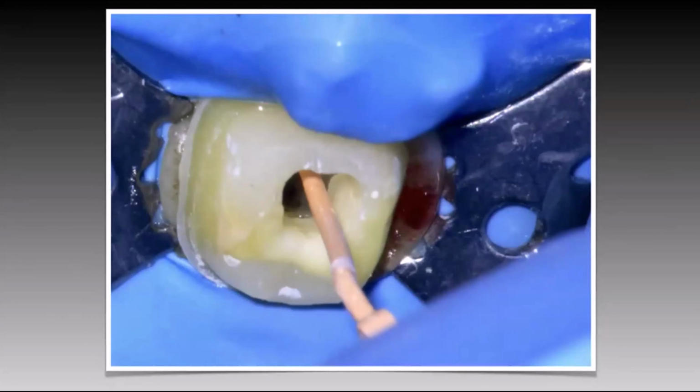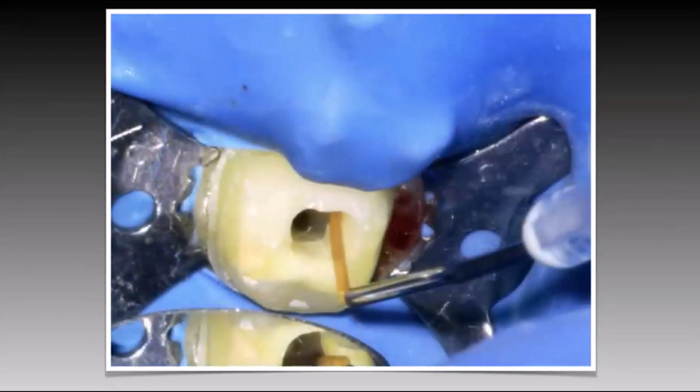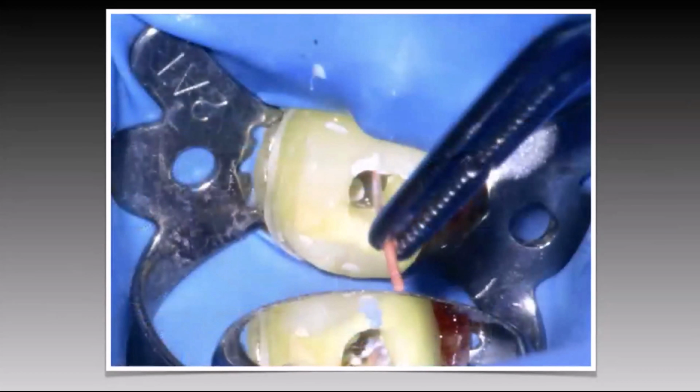And now I'm ready to obturate the case. So I'm going to inject bioceramic sealer. So here's the injection of bioceramic sealer. And then the idea is we want to move that sealer through the canal to the terminus as best we can. And what we do is we use either our master cone, or we can use what has been termed the sacrificial cone, whose sole purpose is to deliver that sealer into the canal, almost painting it along the walls. And then that's it. That's its purpose. And then it gets tossed in the garbage.